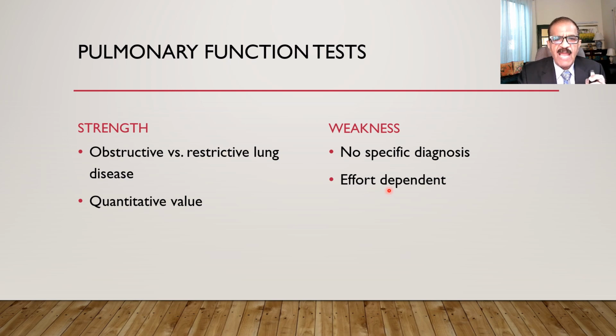How much effort the patient applies, how well the patient understands what to do, and how experienced the technician is, all these can significantly affect the results. So if spirometer functions do not match your clinical judgment, of course you have to review your clinical judgment also, but you can also have the test repeated. Maybe there is some fallacy in the test.